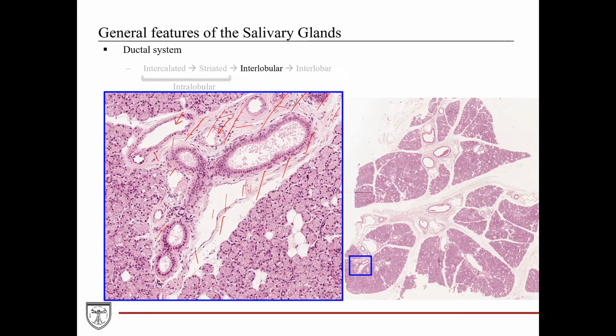and once again in this beautiful slide, we can actually see the transition, the continuum of these ducts and their histology. This, I might argue, is closer to the striated duct within the intralobular ductal system, which is continuing on to become a larger duct, which is continuing on and draining into this larger interlobular duct.